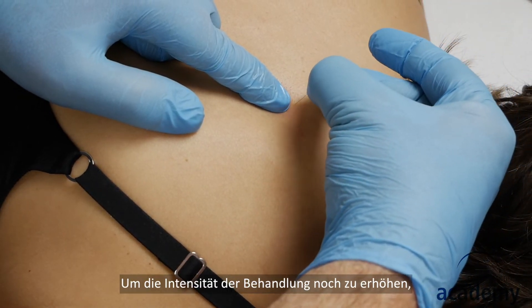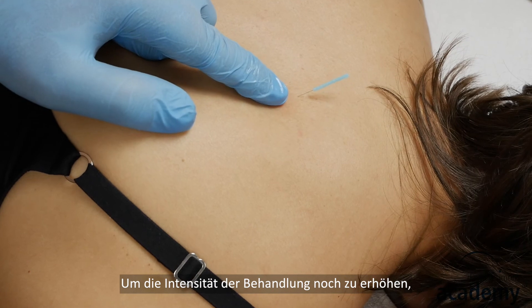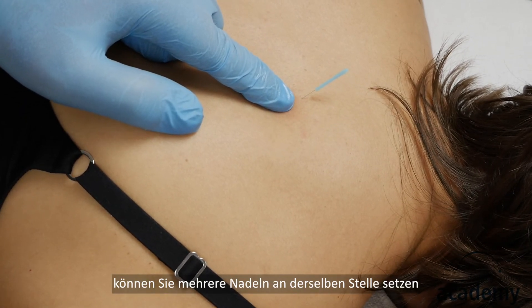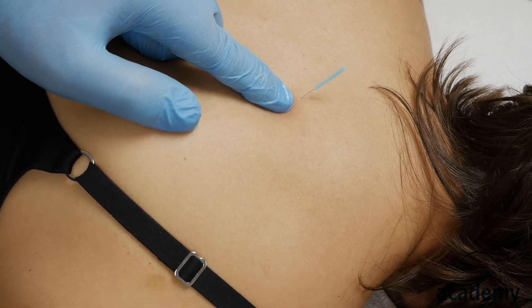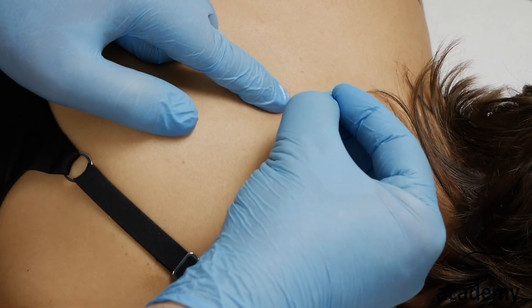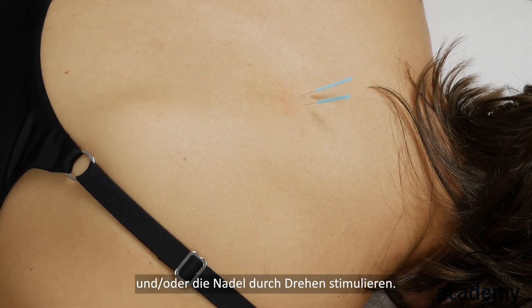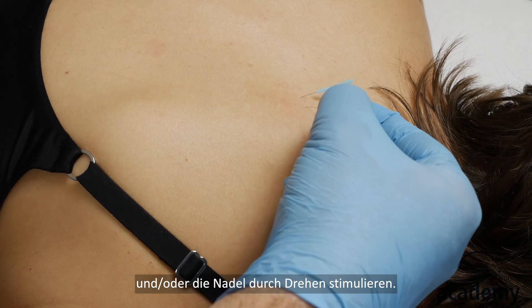To even increase the intensity of the treatment, you can insert several needles on the same spot and/or stimulate the needle by rotating it.